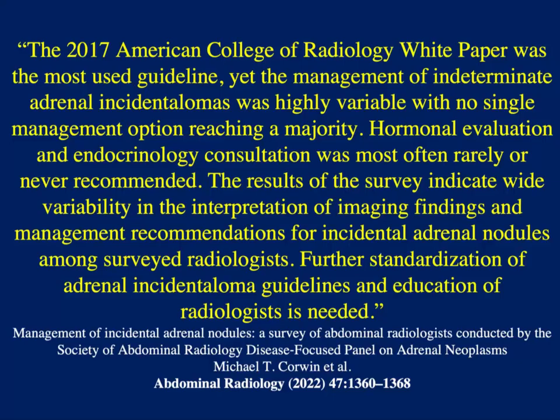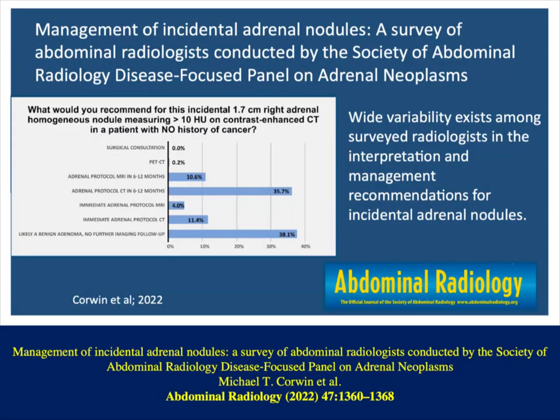The results of the survey indicate wide variability in the interpretation of imaging findings, and management recommendations for incidental adrenal nodules among surveyed radiologists. Further standardization is necessary. And that's the reason, in great part, we're giving this talk, because adrenal lesions are one of the classic things we do in CT, and it's amazing how there is such discrepancy.